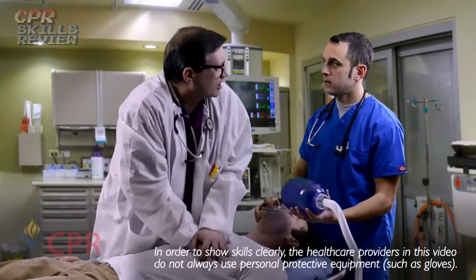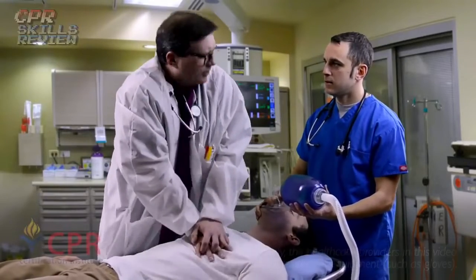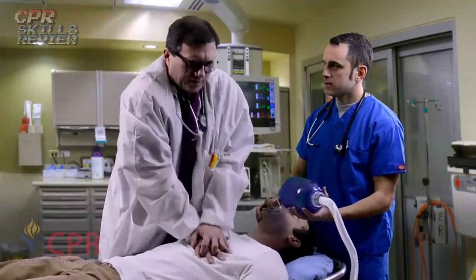Nurse, I've started chest compressions. Hey, get me an AED or a defibrillator right now. What is my compression-to-ventilation ratio? Doctor, we're going to give 30 compressions to two breaths. 30 compressions to two breaths.